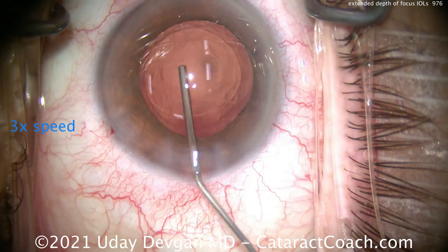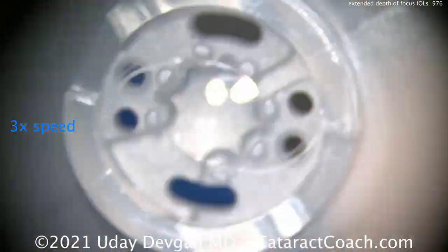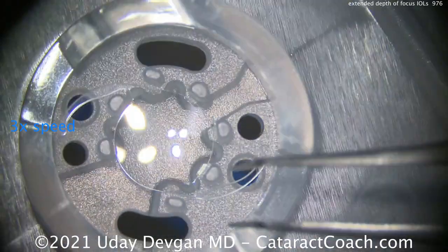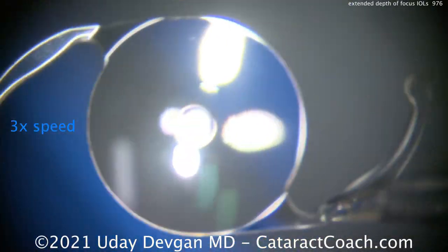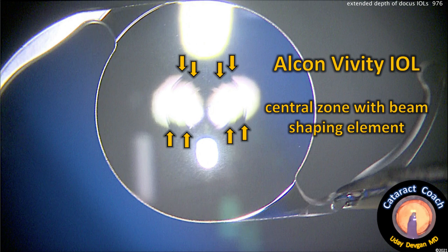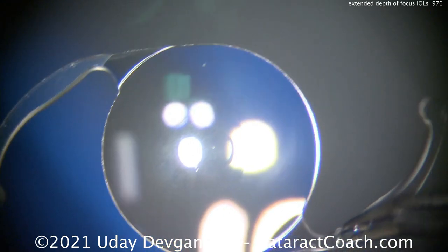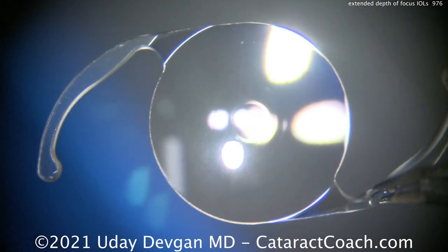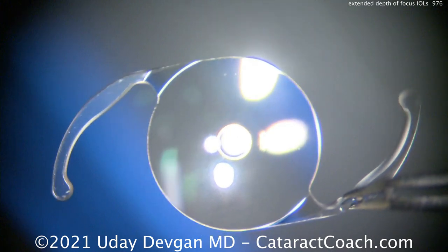You can see that central zone modification, which acts to elongate the depth of focus. Looking at the lens under the microscope before putting it in the eye, we look at the central optic. There are no diffractive rings, but there is certainly a zone with a beam-shaping element, changing the wavefront of the light that enters that central area. You can see how it focuses or changes the shape of the reflected light beam there.